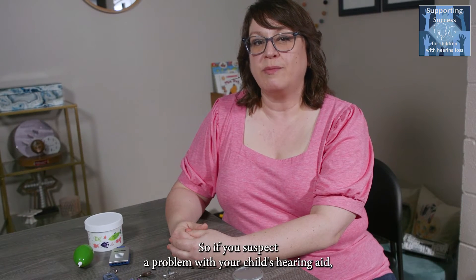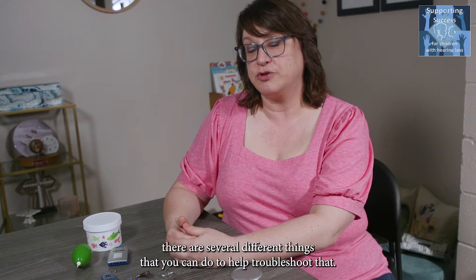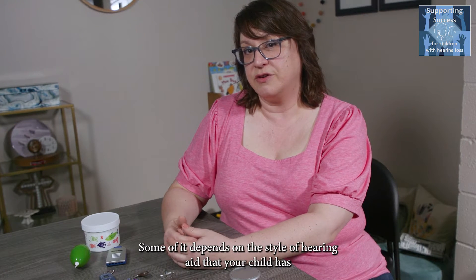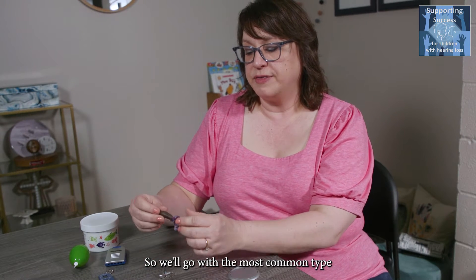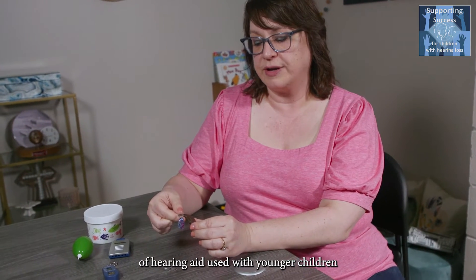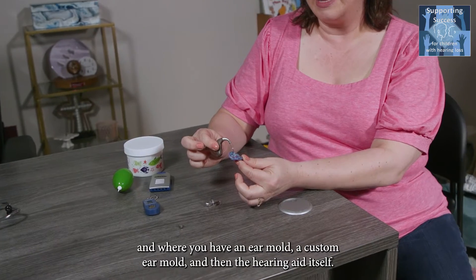If you suspect a problem with your child's hearing aid, there are several different things you can do to help troubleshoot that. Some of it depends on the style of hearing aid your child or student has. We'll start with the most common type used with younger children, where you have a custom ear mold and then the hearing aid itself.